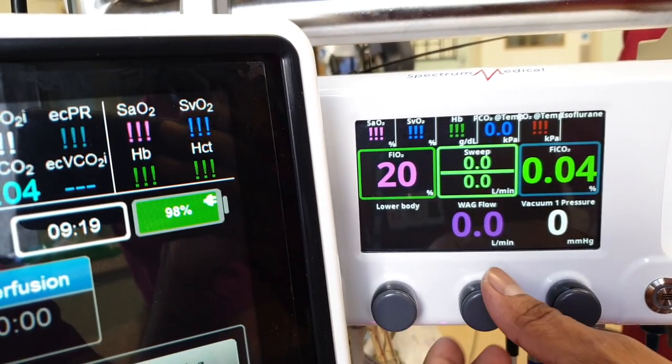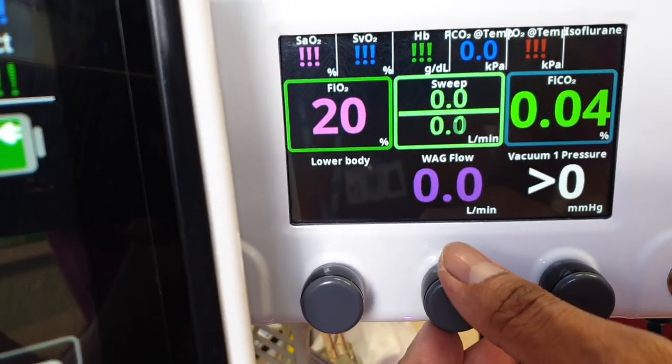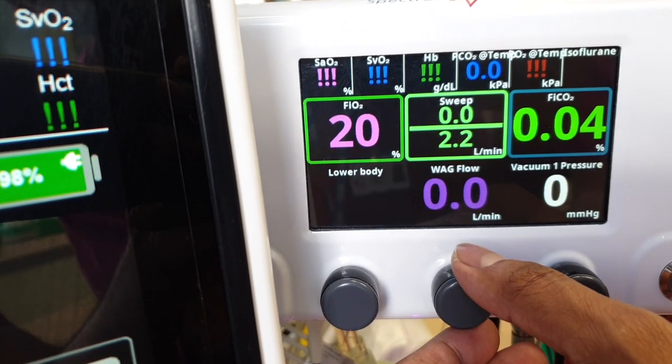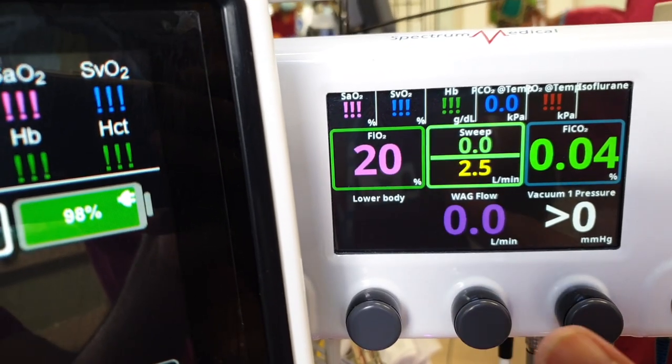You just turn it. That's your sweep. So turn it clockwise. And then you will set it to whatever you want. Then press, push it.